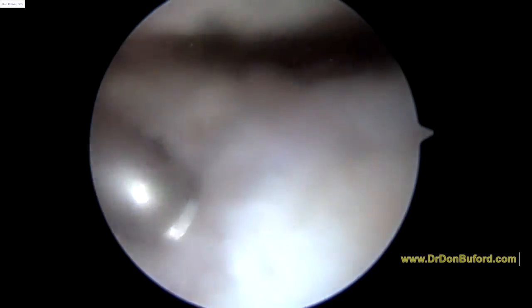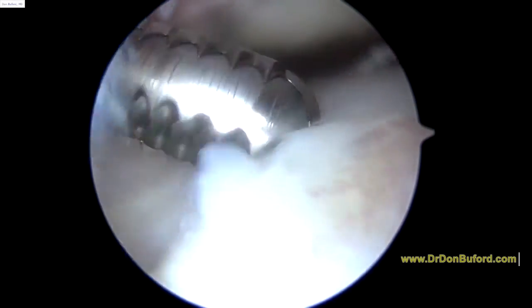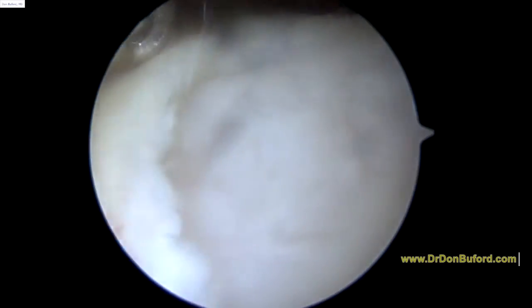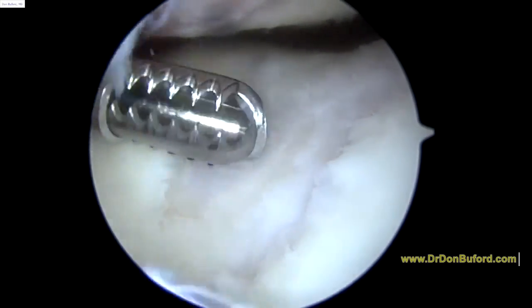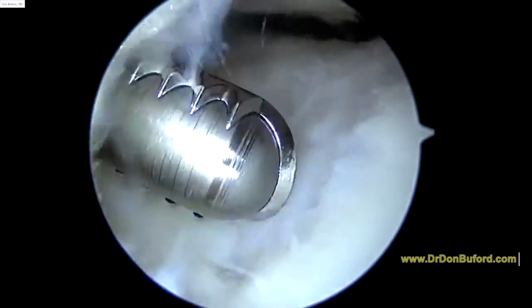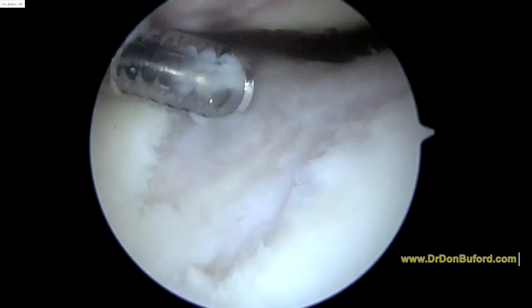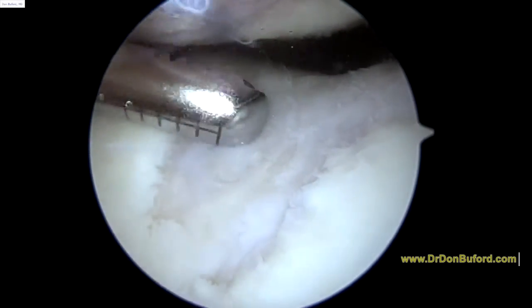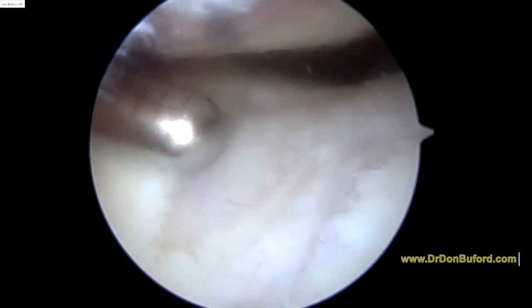Not much more to do other than to try and smooth out any obvious loose areas. You can see the margins here get a little bit loose. Luckily, things are magnified quite a bit on the arthroscope, so it's not as bad as it looks — but it's definitely noticeable and definitely not normal. We are getting a more panoramic view of the trochlear defect here, right where my shaver is. This is also the same kind of area that we treat with stem cells as well.